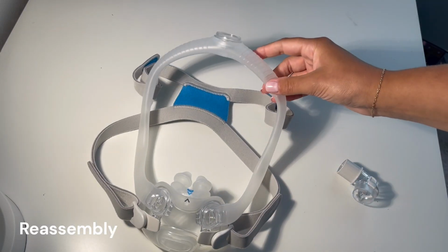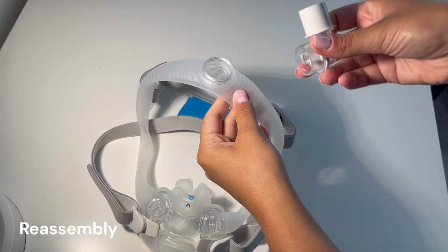Attach the elbow to the top of the frame until it clicks and your mask is ready for use again.